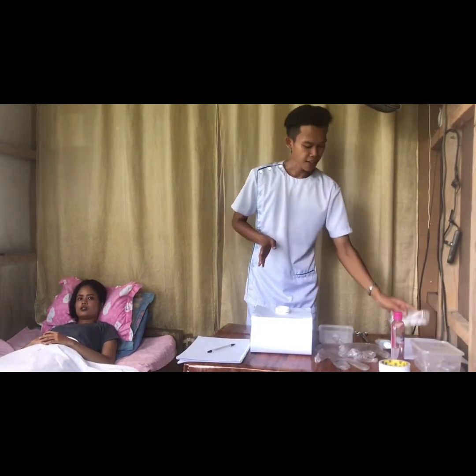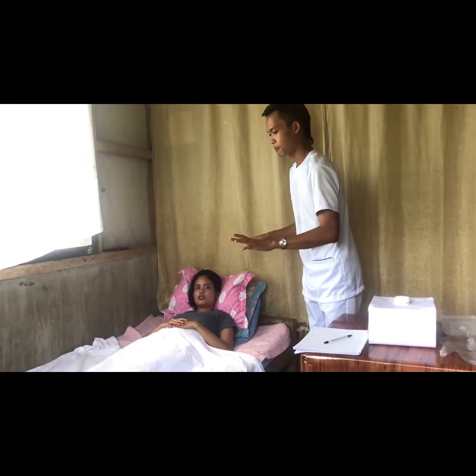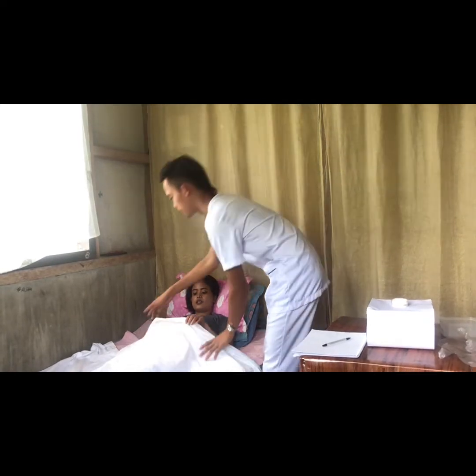Okay, thank you. For this time, I am going to perform pericare for the patient. In performing pericare, we need cotton balls, a basin containing disinfectant solution, and this forceps. As you can see, my patient is lying in a supine position. Ma'am, please place yourself into a dorsal recumbent position, and please keep your feet apart so that I can perform the pericare, okay? I'm going to assist you.